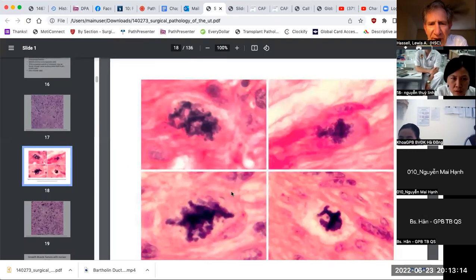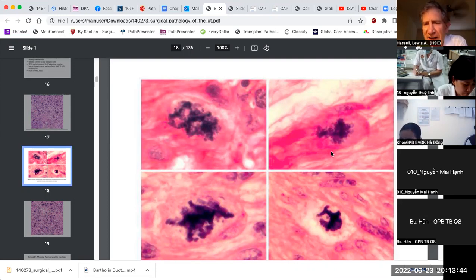They can have sort of karyorrhectic cells like this that look like atypical mitotic figures. And if you thought these were mitoses when I put this up, then you would be in good company. However, if you happen to have the phosphohistone 3 stain, PHH3, this would not stain.